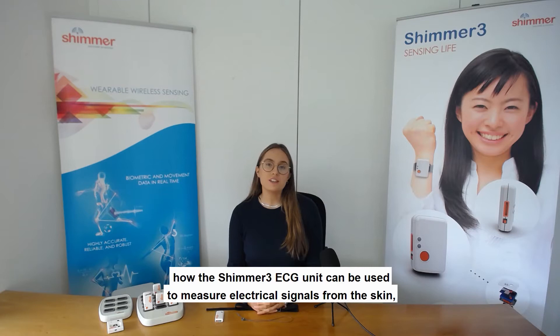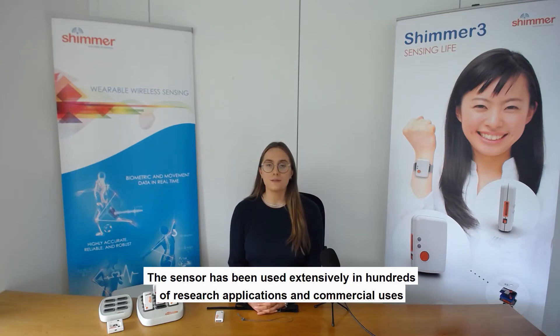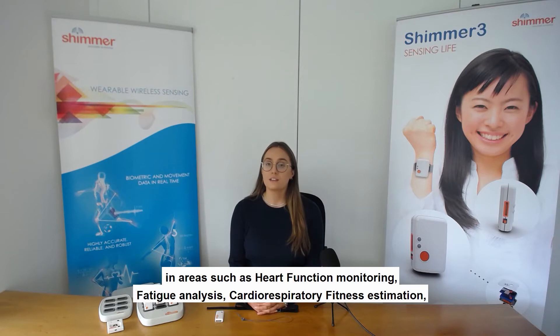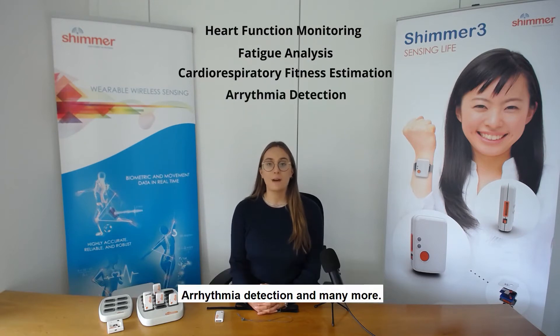This video aims to explain how the Shimmer 3 ECG unit can be used to measure electrical signals from the skin, including ECG data using the Shimmer platform. The Shimmer 3 ECG sensor is recognized as one of the leading tools in the research and commercial industry for wearable wireless sensing of ECG signals. The sensor has been used extensively in hundreds of research applications and commercial uses in areas such as heart function monitoring, fatigue analysis, cardiorespiratory fitness estimation, arrhythmia detection, and many more.